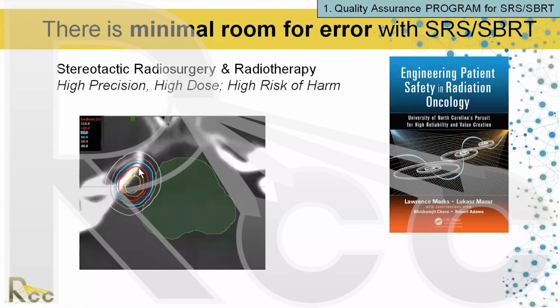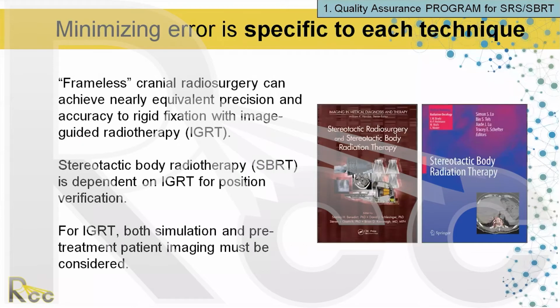And this image over here is just showing how critical it is to get everything right. So if you've got a dose calculation right up against the bone in the brain, and in between right next to the brainstem, it's really critical you get that right. Because a little shift, you're going to give the brainstem too high of a dose. And if the dose calculation isn't correct, you're not going to actually accurately display that. So it takes a lot of work to get this set up, but we also know that these treatments are effective.